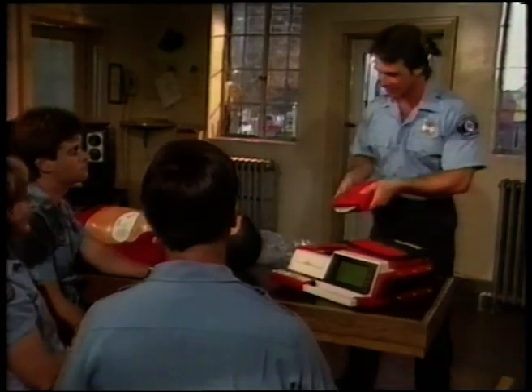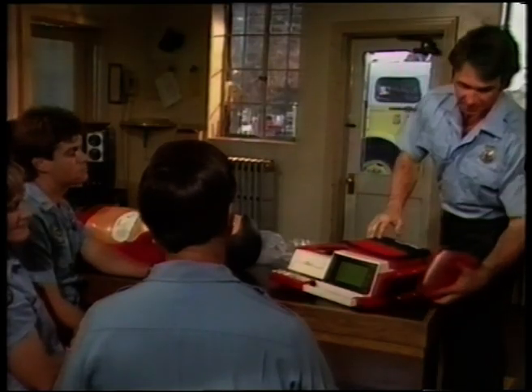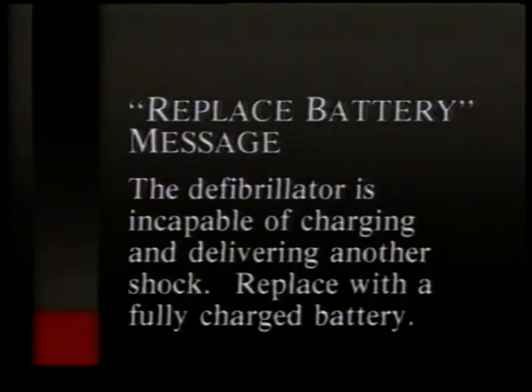However, this time may vary and should not be relied upon because battery age, level of prior maintenance, and temperature can adversely affect battery performance. While the low battery condition exists, a replace battery message may occur during defibrillator charging. The replace battery message indicates that the LIFEPAK 300 battery pack is at such a low capacity level that the defibrillator is incapable of charging and delivering another shock.